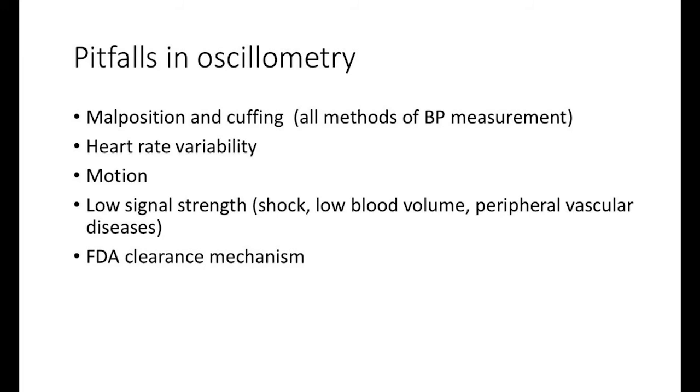So all these smartphone apps, you can spend up to $5 on one of these smartphone apps to do your blood pressure at home and keep track of it. Those are completely unregulated and completely untested in terms of their validity. But when it comes to oscillometric devices, the FDA doesn't validate them. They clear them, and they clear them through a thing called predicate device. And 80 to 85% of the devices you can buy for a patient or a patient can buy in a drugstore have never actually been validated. They've simply been cleared based upon a prior predicate device.